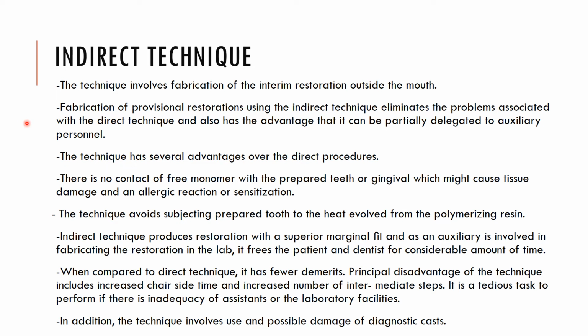The technique has several advantages over the direct procedure. There is no contact of free monomer with the prepared teeth or gingiva, which might cause tissue damage, an allergic reaction, or sensitization. The technique also avoids subjecting the prepared tooth to heat evolved from the polymerizing resin.